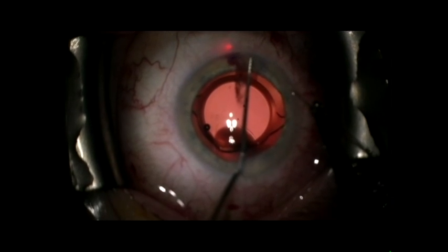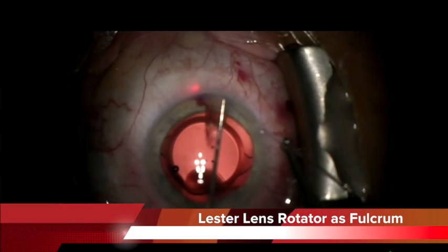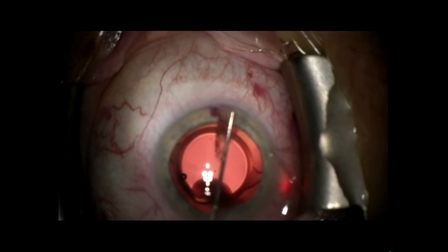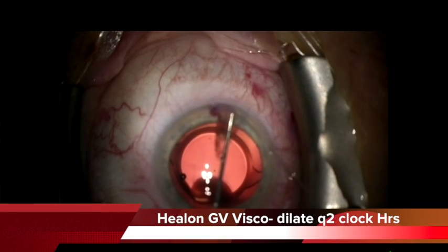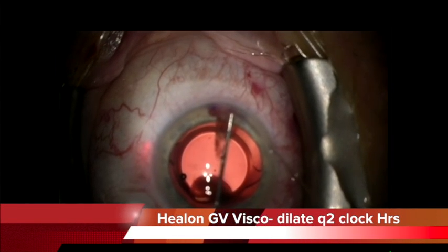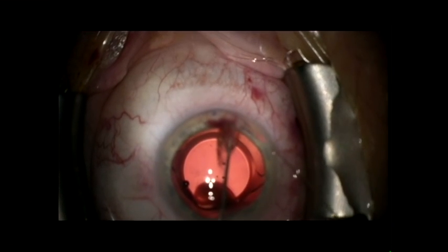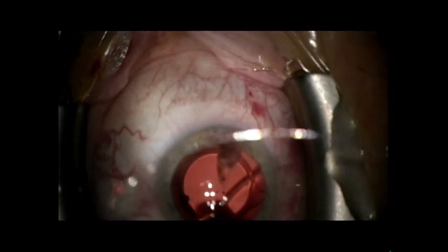Here I have inserted a Lester lens rotator and am holding it up against the catheter so as to help act as a fulcrum to avoid traumatizing the canal. Every two clock hours, my nurse turns the dial on the Helon so we introduce Helon every two clock hours as we are smoothly withdrawing the micro catheter.